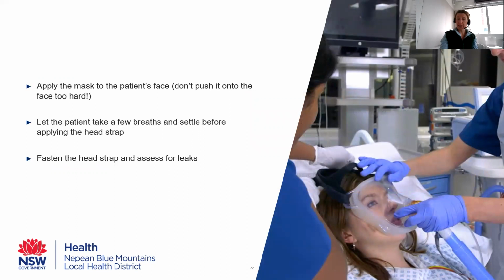When you're actually applying the therapy to the patient, you want to push the mask onto the patient's face, but not too hard. So you don't want the hard plastic on the patient's face. Yes, we need to apply firm pressure because we want an adequate seal. We don't want the gas flow leaking out of the side of the mask, but we don't want to be creating pain, and we want to try and reduce the incidence of pressure-related injuries.